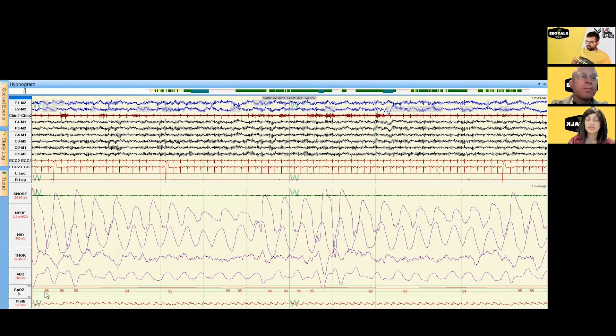Truly, the way we measure sleep is through EEG, so all of our staging and looking for arousals comes from the EEG — that's why we have it here. This is a limited EEG montage. If we have a concern for sleep-related seizures, parasomnias, or other issues where we want a full extended EEG montage, we do have the capability of doing that, though it's not the default for a baseline PSG.